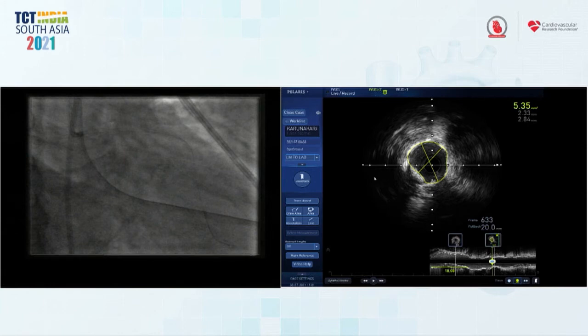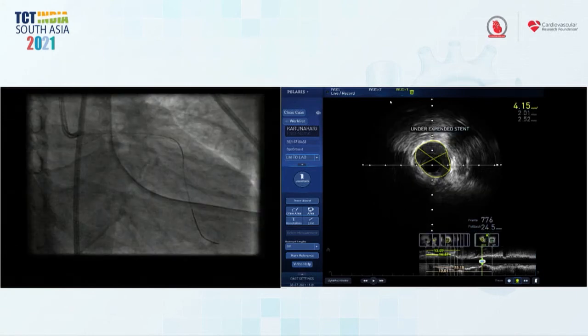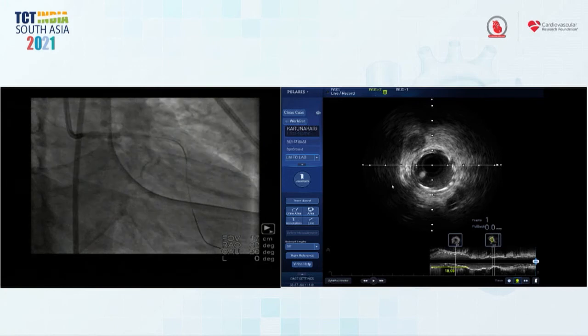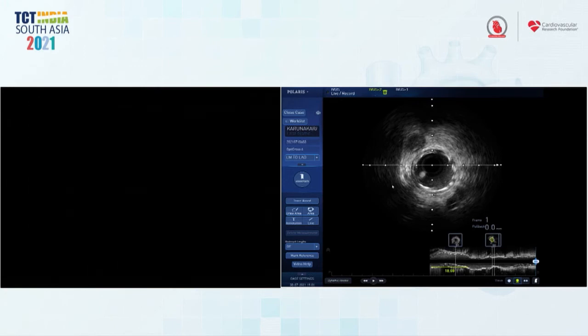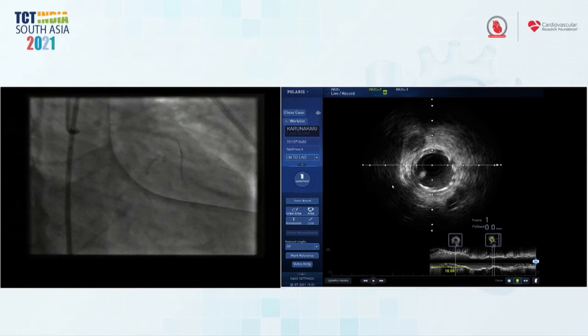So I think we have a few minutes. We'll take some shots and show you what we did. We're slightly over time, so maybe just a final angiogram. Yeah, we are done. So that's the left main. Looks great. I'll just hold the wire there for the final IVUS, but just show the LAO caudal, please, one more view, and then we'll take the IVUS down.